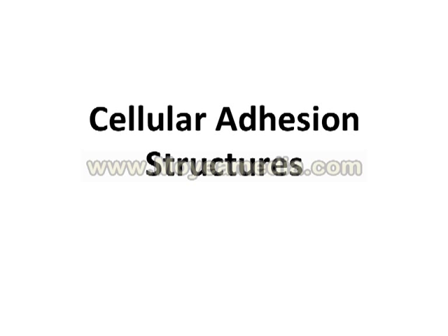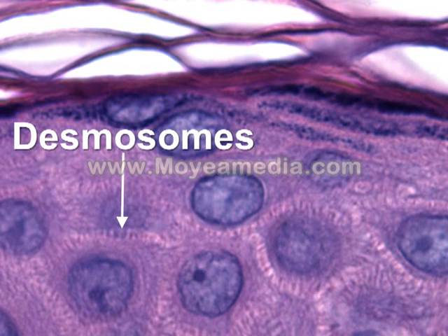Next is discussion of the cellular adhesion structures that keep our skin together. Desmosomes are the cell-cell junctions and form visible connections in H&E sections, in fact give rise to the spiny appearance of the spinous layer.